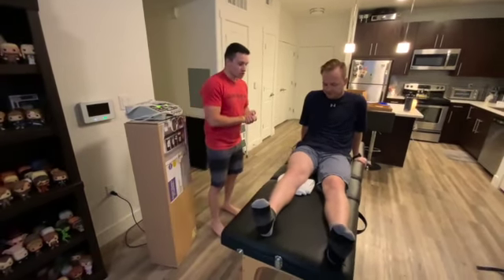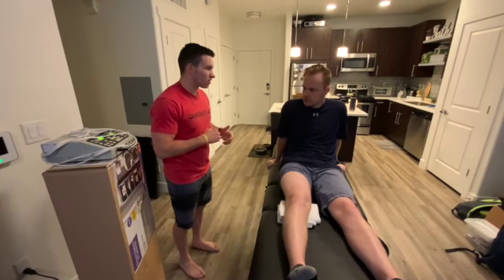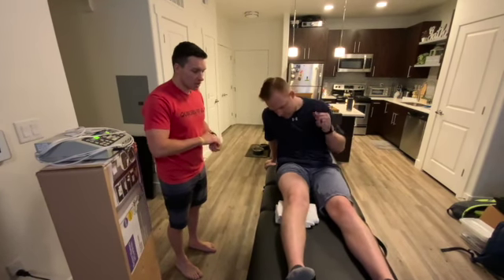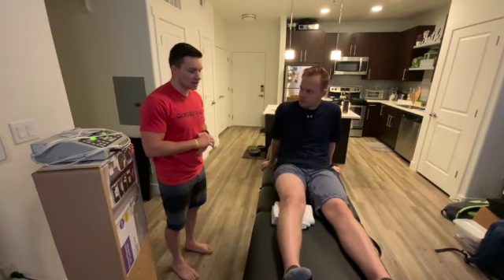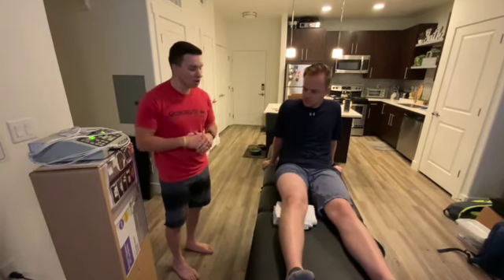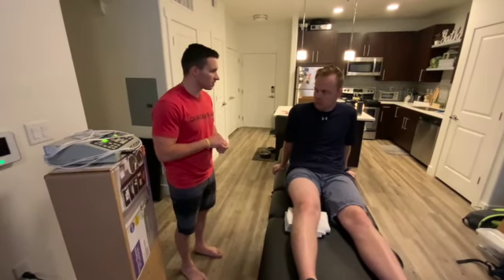Thank you. So Colton, from going through everything with you earlier, I did notice that your pain's super high, kind of an 8 out of 10 when you're moving around walking. Is that right? Yep. Okay, so since we've already done our exercises, I want to put some electrical stim on your knee to help decrease the pain, if that's fine with you.